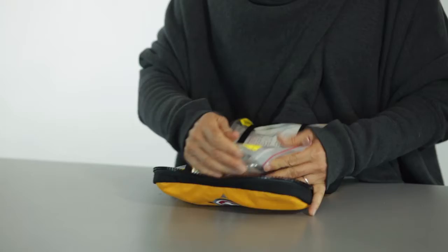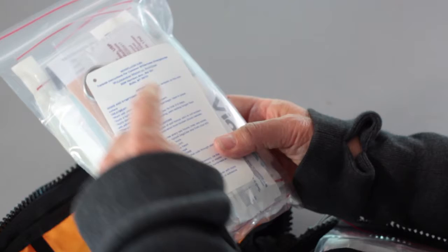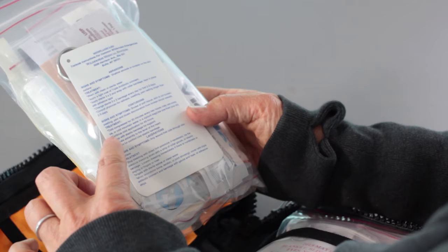This module has your bandages and things for wounds. It also has a really handy waterproof instruction card, which has just simple things to do for abrasions, contusions, lacerations, and just those minor things that you need a reminder of how to treat.